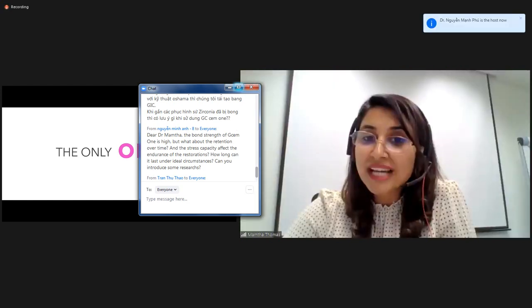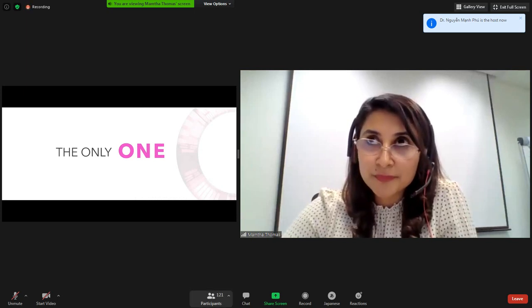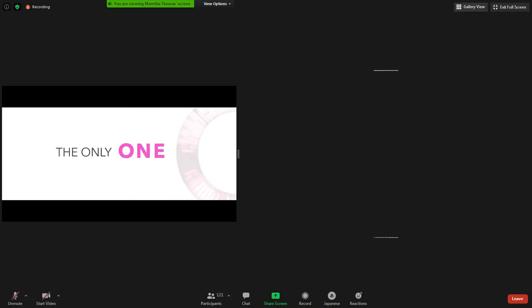Yeah, for zirconia and metal, you don't have to pre-prime with any kind of agent because the cement already contains MDP.